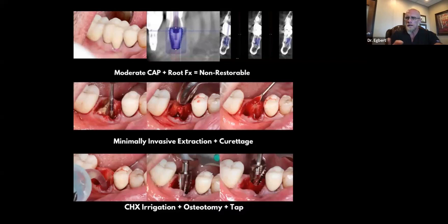So of course, one of the most important things to do when you're using your CT scan is to rotate the image so that your measurements are going along the long axis that you're planning on placing that implant. We see attendees and residents all the time that take a CT scan, they're measuring at the wrong angle. So please familiarize yourself with the rotation tool to make sure that you're rotating that computed tomography image, the CT image, to its appropriate angle, if you will, or vector.